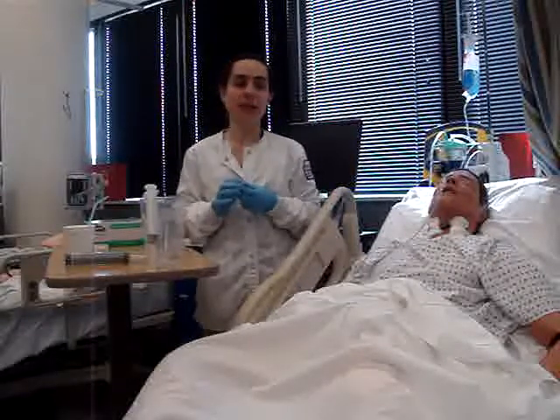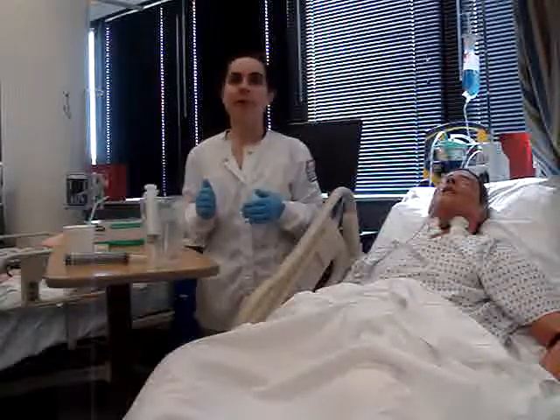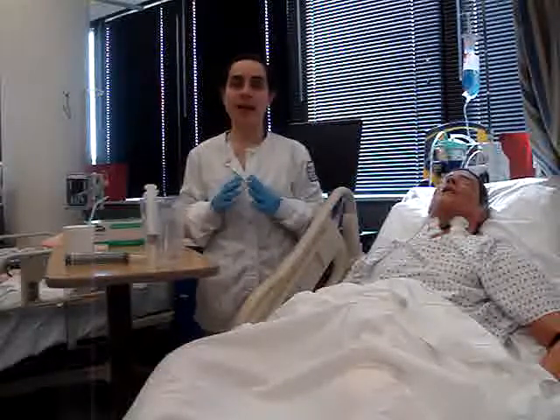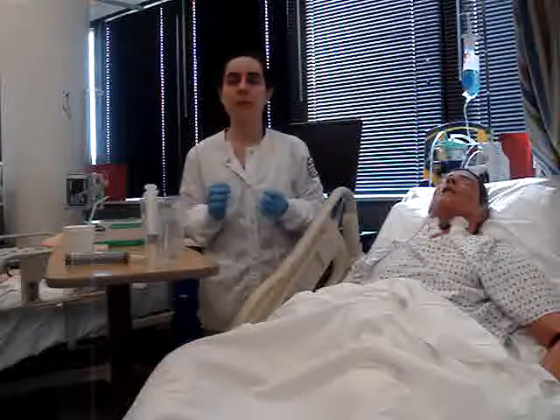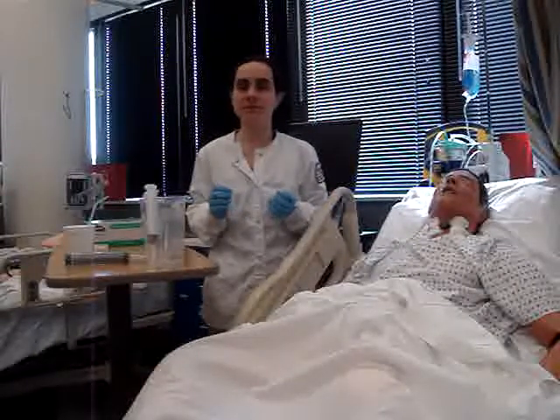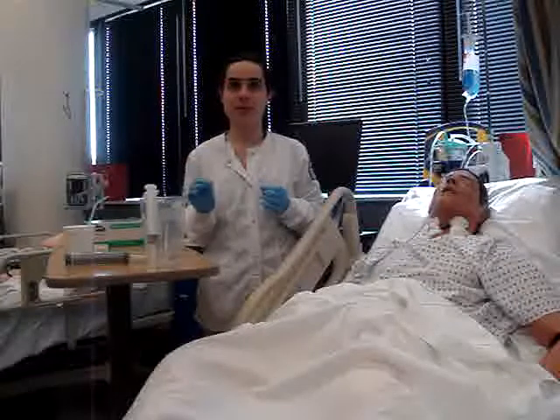For the 2 types of feeding that we're going to do, for the intermittent feeding, I'm going to check the stomach contents prior to feeding each time. And for continuous feeding, I'm going to do it every 8 hours or depending on the agency protocol. What I want to do is flush the tube with 30 milliliters of sterile water. And in neonate patients, I'll flush with the lowest amount necessary so I can check the patency of the tube.